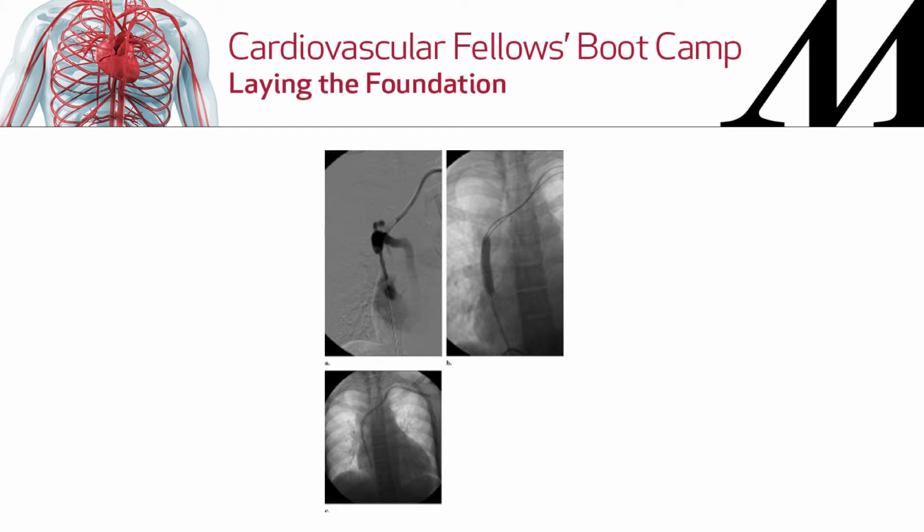Here, these are pacemaker leads. Pacemaker leads are often associated with central vein stenosis because they're sitting against the vein and causing that stenosis. You can do balloon angioplasty around those pacemaker leads, as you have here in this picture, and it'll give you some temporary benefit. The truth of it is, though, it's just going to keep coming back. So it's best not to create a dialysis access on the side of a pacemaker.